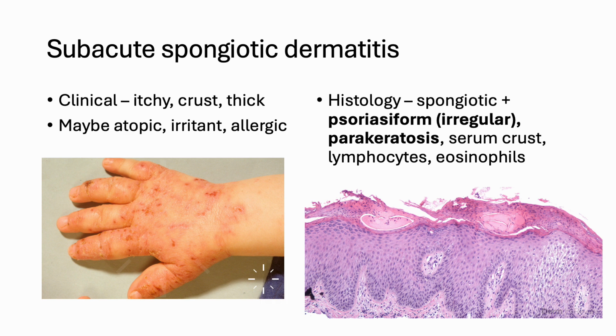Histologically, instead, we can still see there is spongiosis, but the vesicles, they are gone. See, you don't see those vesicles. Instead, the epidermis starts to grow down. The reason is because the irritation will cause itch, and when the patient starts to scratch, the irritant plus scratch will cause this hyperplasia of the epidermis. So we call this psoriasiform.